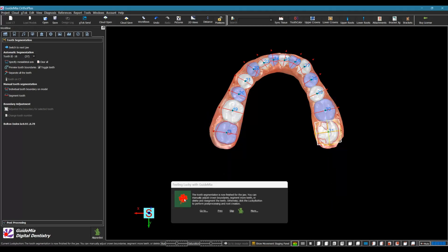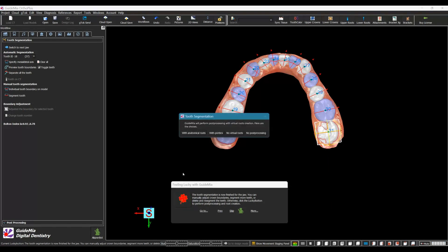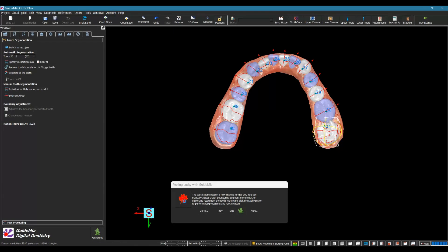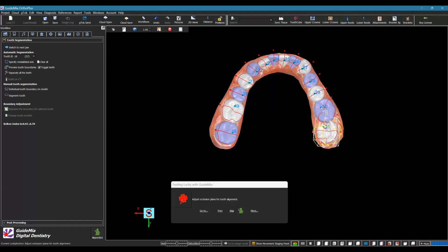The tooth segmentation is now finished for the lower jaw. You can manually adjust crown boundaries, segment more teeth, or delete and re-segment teeth. Otherwise, click the Lucky Button to perform post-processing and root creation. It is recommended to inspect all tooth boundaries and make necessary adjustments — just right-click on the tooth model and select the menu item. If some teeth are not segmented, use the manual segmentation tool on the left side of the workflow panel.